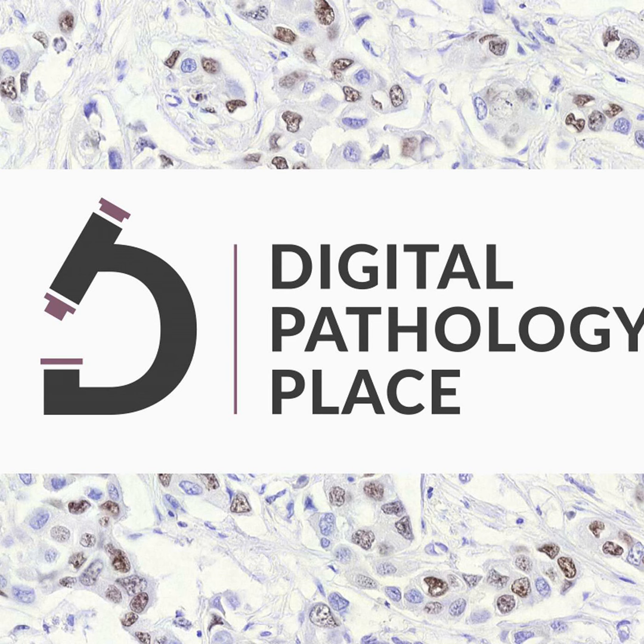They're all well suited. As I said, they each have their advantages, they each have their disadvantages. If you're doing a low plex several times, you can get ideal staining conditions for each biomarker. But tissue is precious, and maybe you want to be able to do all of your biomarkers at the same time. I would suggest that whichever modality you're choosing, it really is best to carefully plan the experiment and plan the assay so that you can get the results that you're looking for, rather than just dumping a whole bunch of biomarkers on a piece of tissue and hoping you can interpret the results.